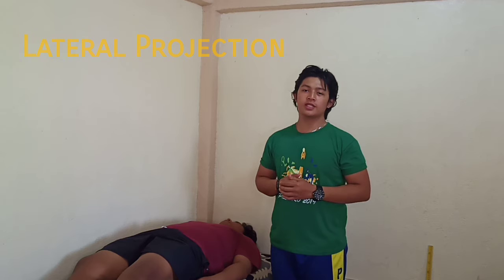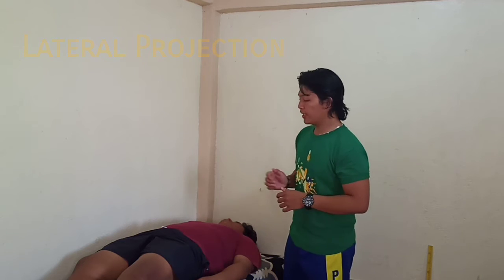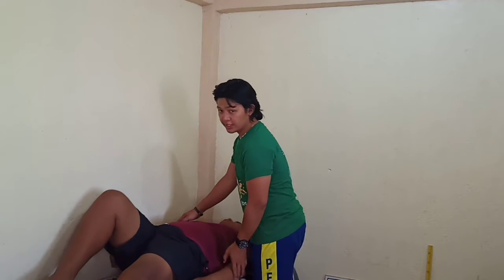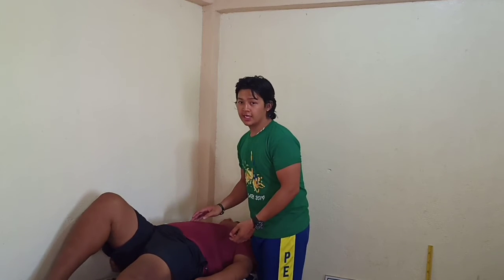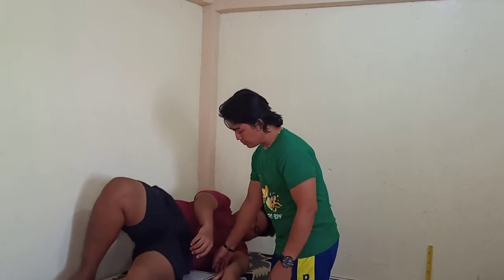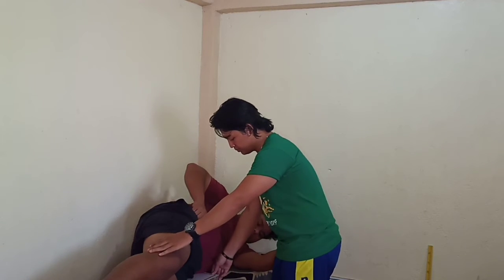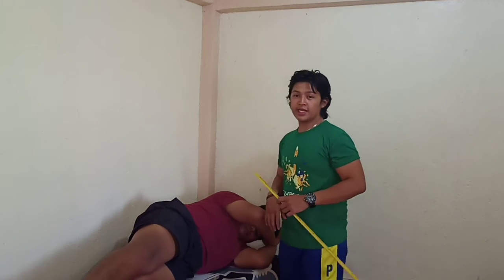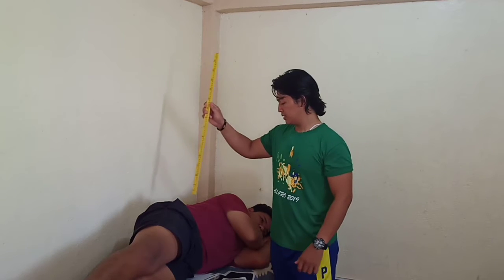The second projection is the lateral projection. Place the patient in lateral recumbent. In this case, the patient is in left lateral recumbent. Use an 11/14 image receptor and center the image receptor at the level of the iliac crest. The central ray must be perpendicularly directed at the level of the iliac crest.